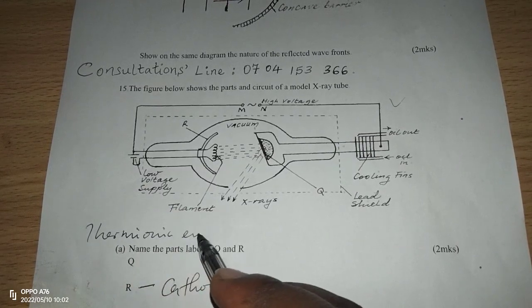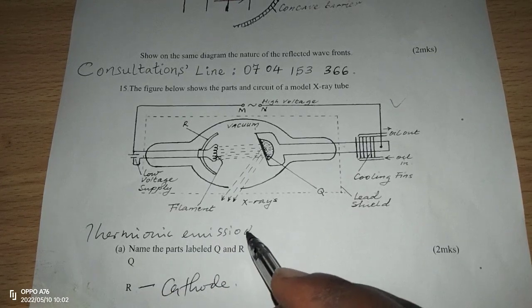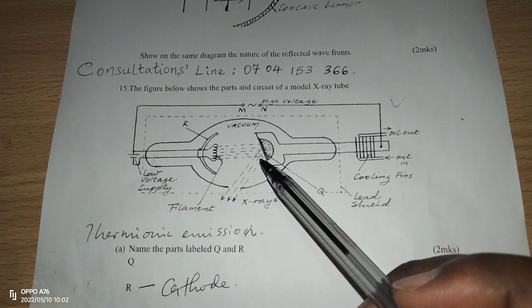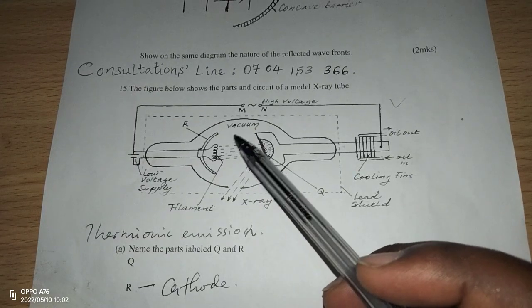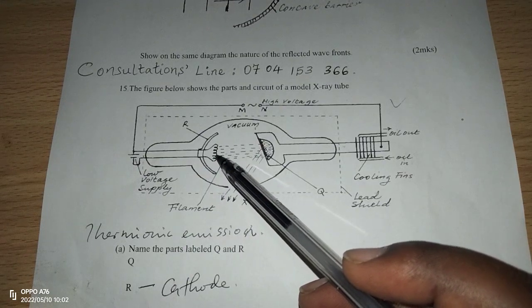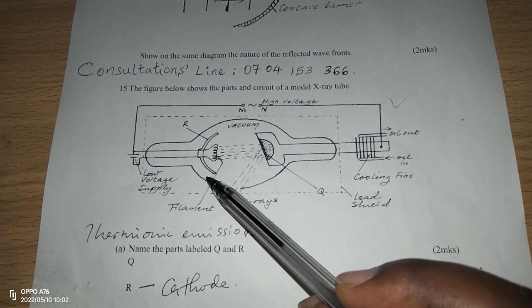Thermionic emission is the dislodging of electrons from a metal surface due to heat. When thermal heat is supplied by the current in the heater filament, we have electrons dislodged from the surface of the cathode.